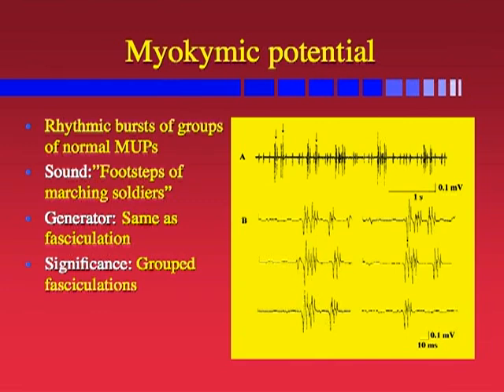The reason for this is that in clinical myokymia, other EMG potentials can be observed: continuous fasciculation and continuous muscle fiber activity, or neuromyotonia. Myokymic potentials are essential findings in myokymia cramp syndrome. Myokymia is most frequently seen in Isaac's syndrome, demyelinating neuropathy, radiation plexopathy, and timber rattlesnake envenomation. Watch and listen to myokymic potentials.